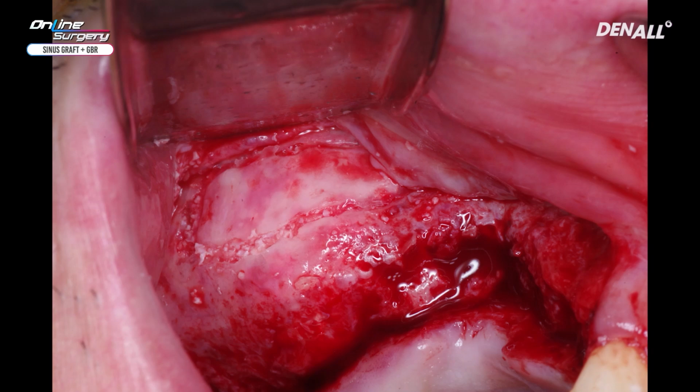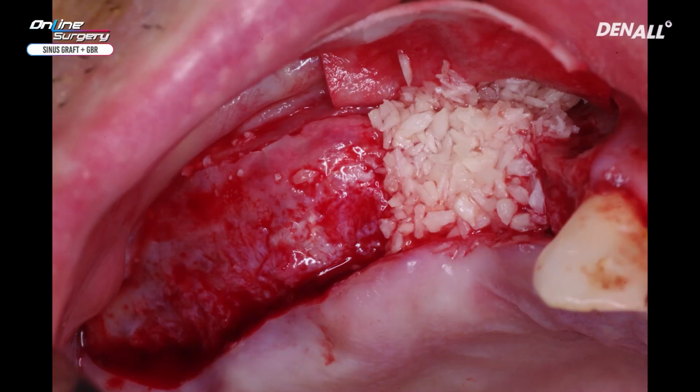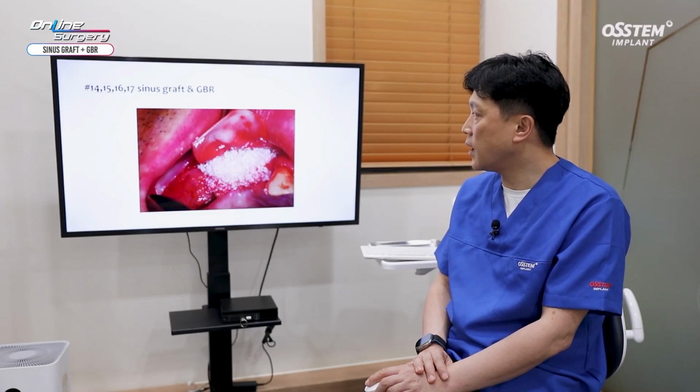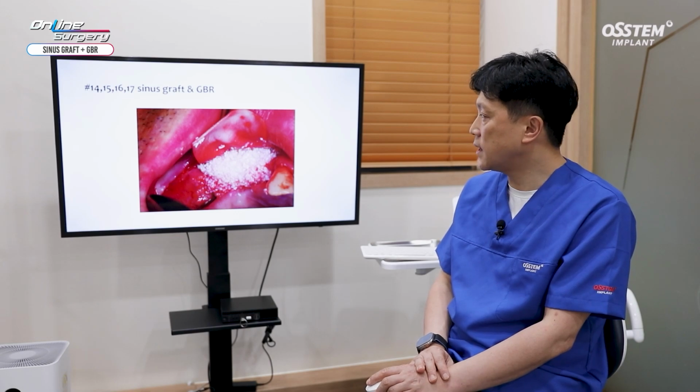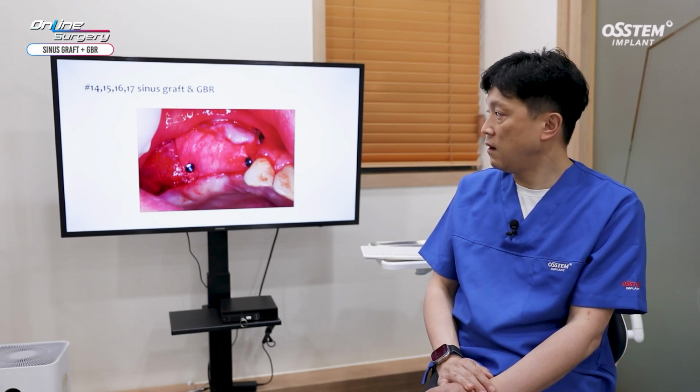As shown, cortical bone perforation was done first. If you look below on the inner surface, FDBA cortical chip was used. Allograft was used, and on top, xenograft AOS was used to resist remodeling. Collagen membrane was used with bone tack. In the past, I've used the open membrane technique for GBR, but the results were not really good. Hopefully, I will be able to achieve better results. You can see that surgery was completed nice and clean.